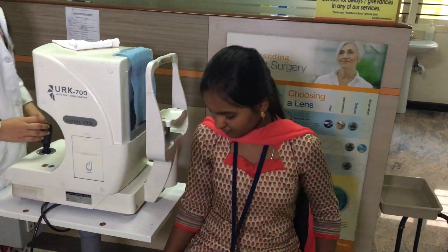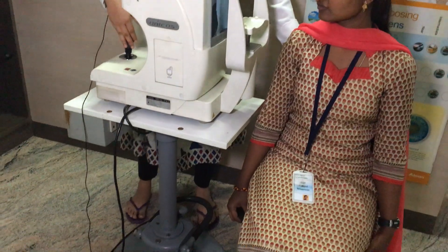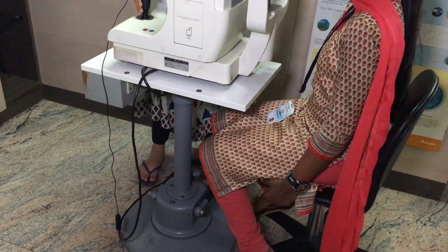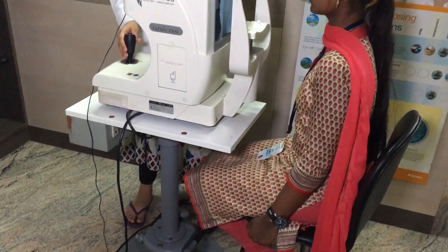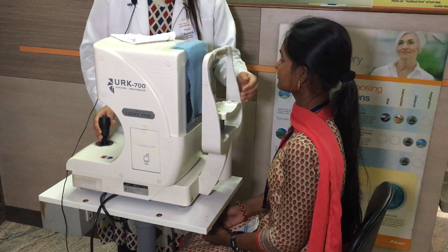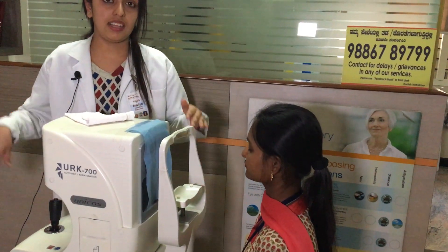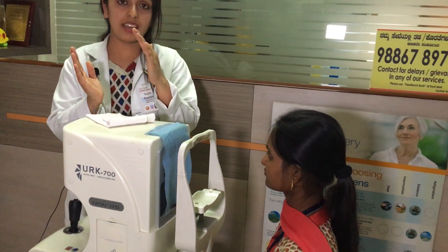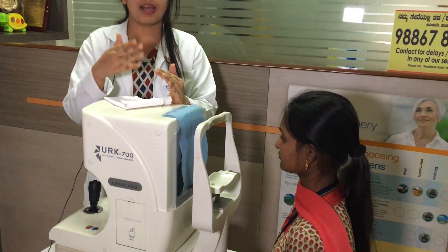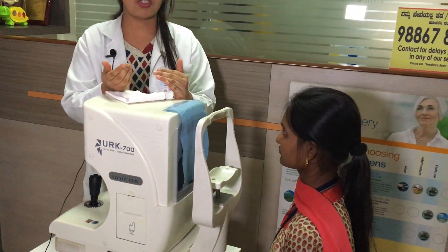When I talk about this chair, the position will be straight. The head position will be straight. There are chances that the power fluctuates without the correct position.